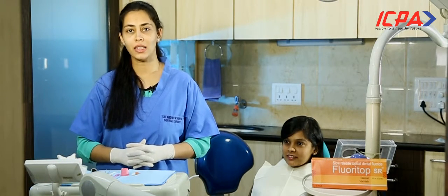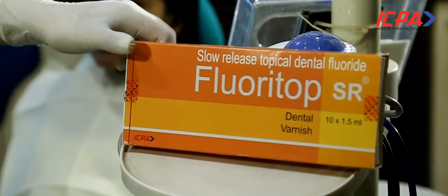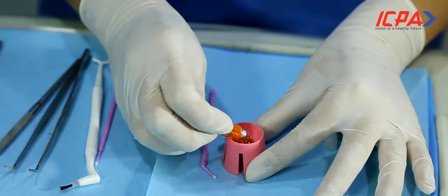Today we're going to talk about fluoride varnish. Fluoride varnish contains 50 milligrams of sodium fluoride. It is a treatment that dentists use to help protect teeth from sensitivity and cavities.